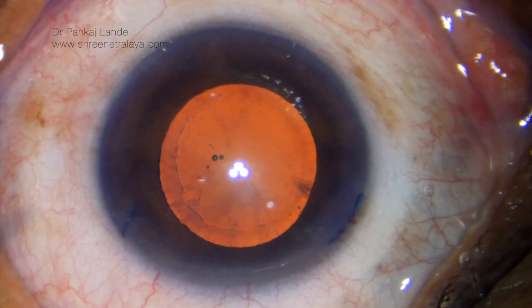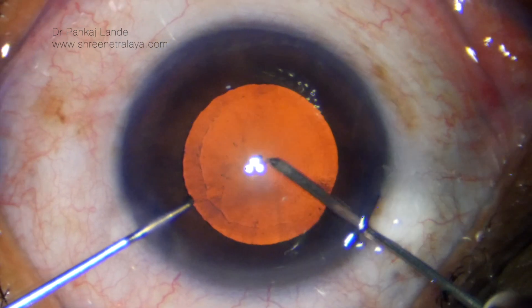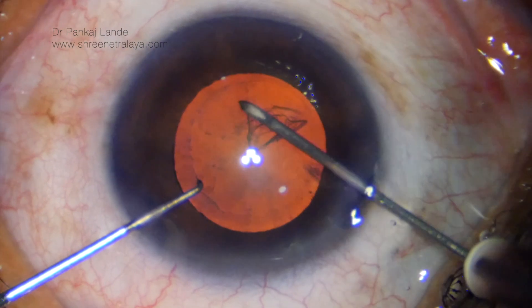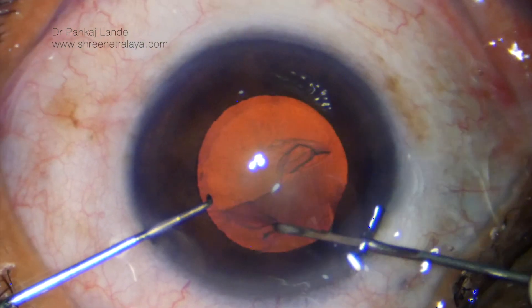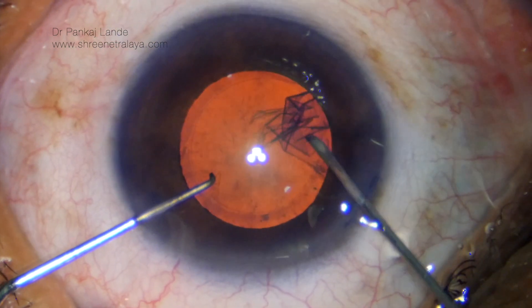The AC is now filled with viscoelastic — do not overfill the AC. Rhexis is performed with a cystotome. A 5.5 millimeter rhexis will be sufficient in this case, and you can see the pseudo-exfoliative material border is acting as a guide for the rhexis.